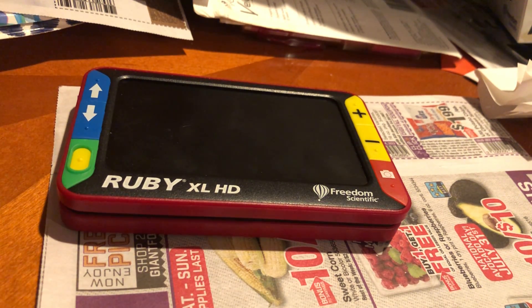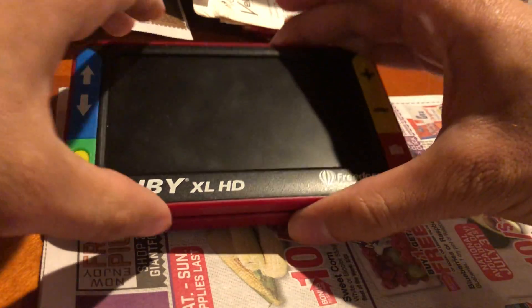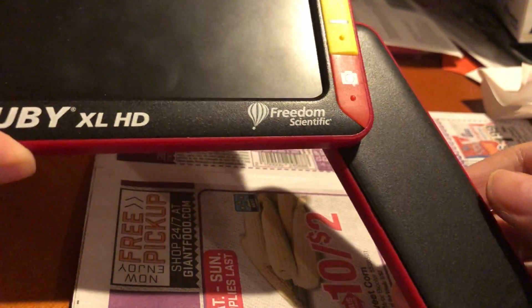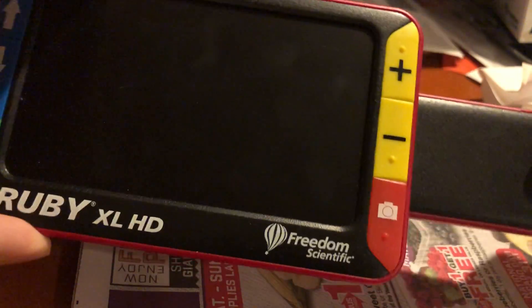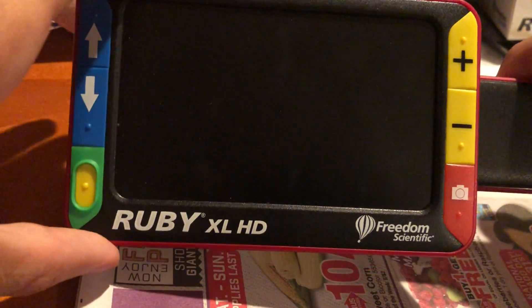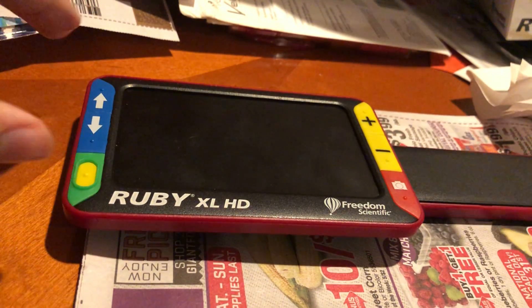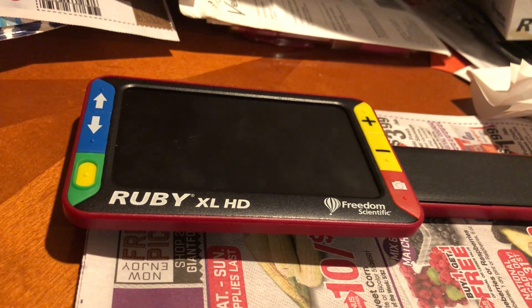It has a swing-out handle that can be set to two different positions: 45 degrees, or straight out like a standard magnifying glass. There's also a stand that unfolds from the rear of the device, which positions it at a 45 degree angle.